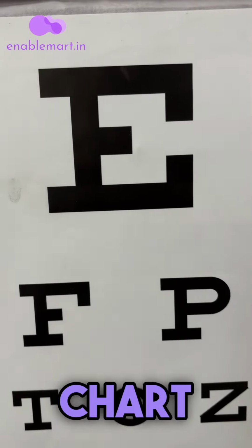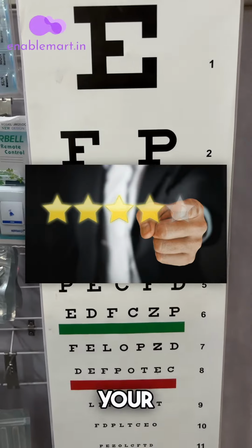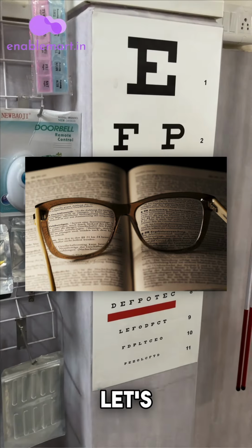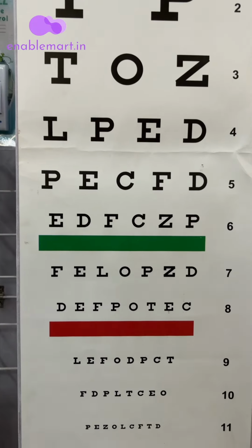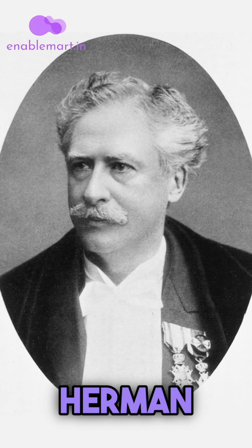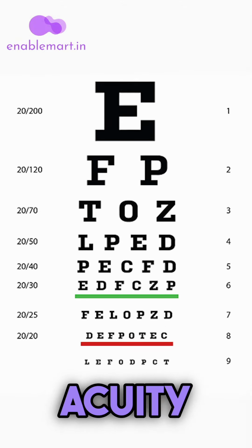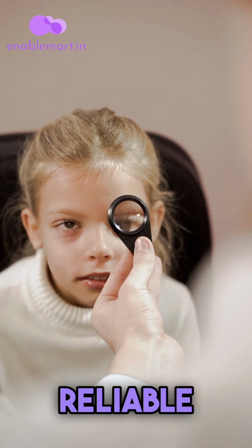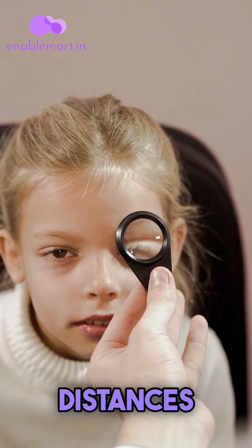Welcome to the Snellen Chart Vision Test, a simple yet effective tool for assessing your visual acuity. Let's explore how this chart helps measure the sharpness of your vision. The Snellen chart, named after the Dutch ophthalmologist Herman Snellen, is a standardized chart used to measure visual acuity. It's a quick and reliable way to determine how well you can see at various distances.